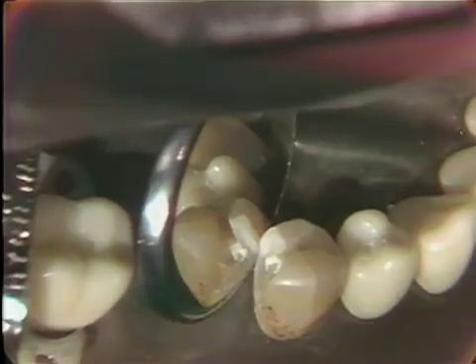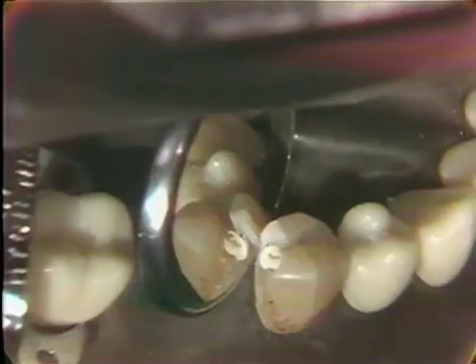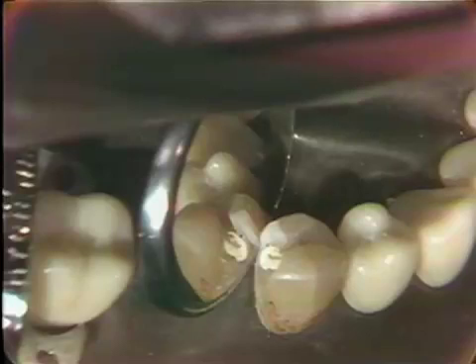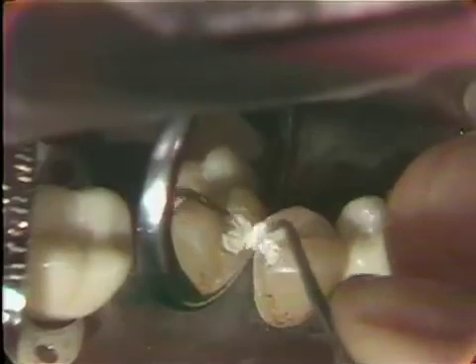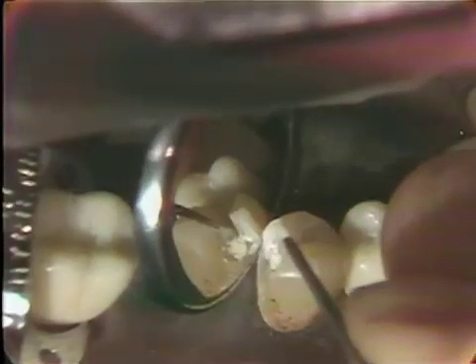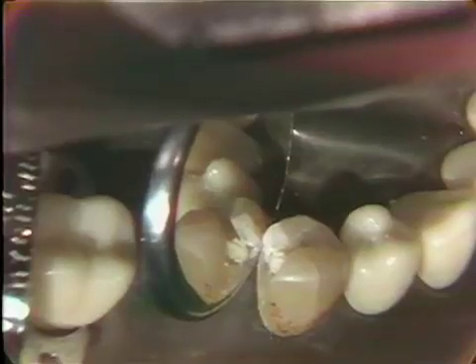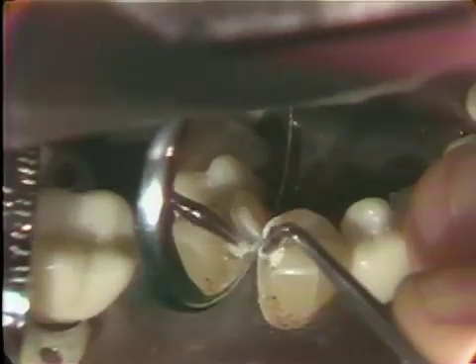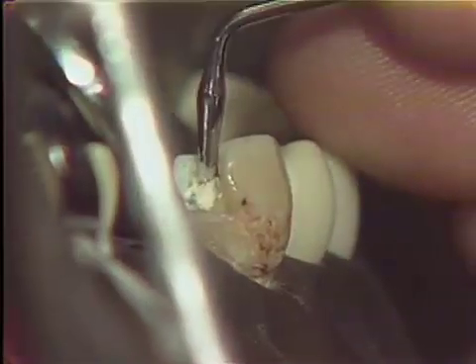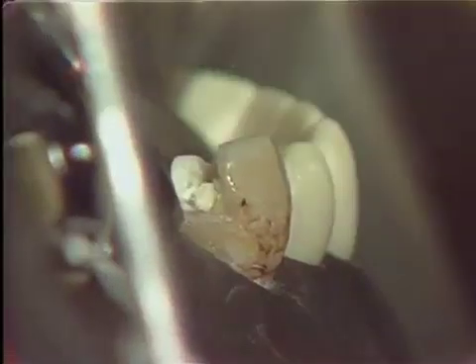Then the small amounts that you have cut will be placed on the back of a spoon excavator or some suitable instrument and brought into the cavity preparation. Remember how small these were — notice it is still too large, but this is fine. Notice it did not stick to the instruments; we have not lubricated or done anything to the instruments. Now with the spoon excavator you take off the excess with a very gentle burnishing action. A 25C can be used to actually shape this cement base as desired. Notice the tapping, burnishing action — and now the cement base is in place.